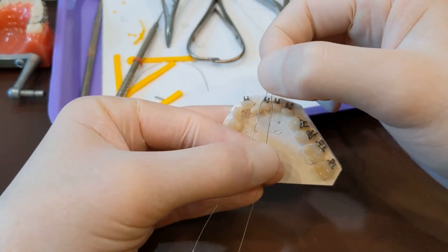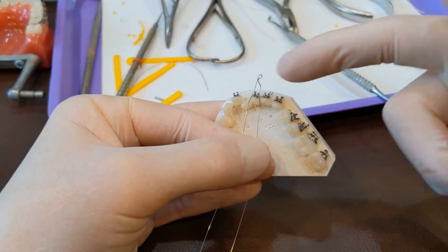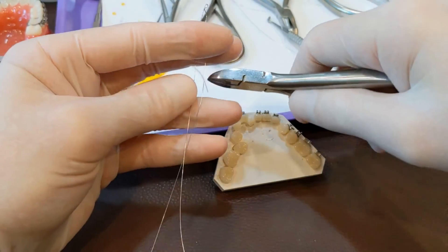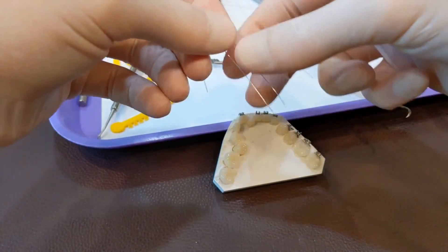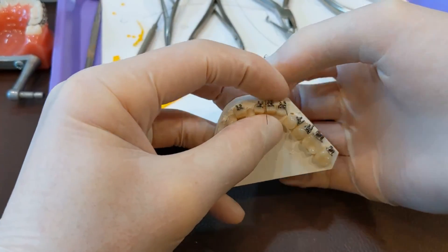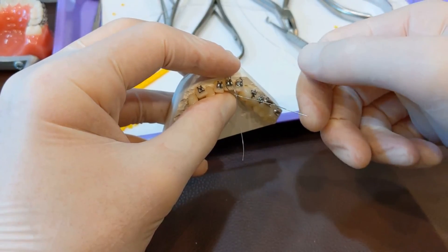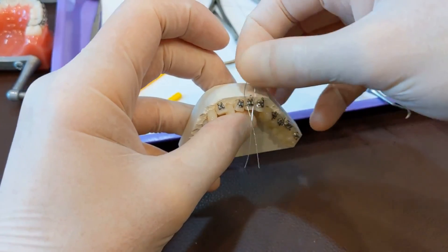If you realize that you need a Kobe tie or Kobe hook after you have the wire all tied in, you can put these on after the wire is in. You just want to trim a bunch of the extra wire off — take it to about here and clip both those off. Then thread this under the wire, and once it's on there, roll it over, grab it with your closed mathieu, and tighten it up just like before. So you don't have to have the wire out — if the doctor calls for this after the wire is in, you can still put one on without having to untie everything.